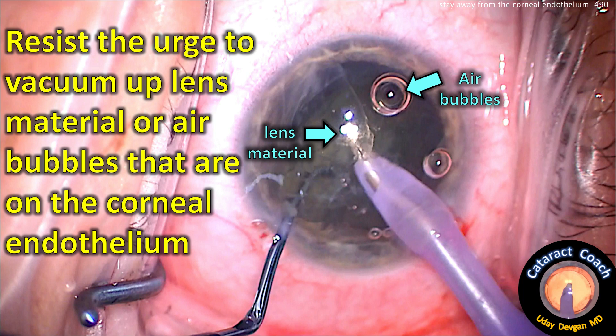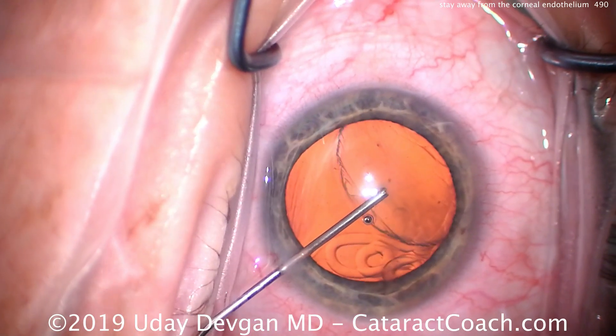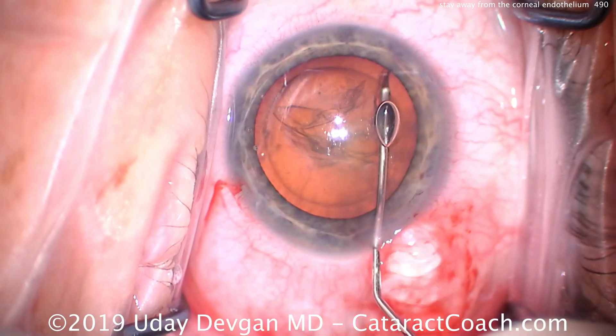Resist the urge to vacuum up lens material or air bubbles that are on the corneal endothelium. This is an important point. If you do a case like this and you see lens material pushed up against the cornea, you want to leave it be.